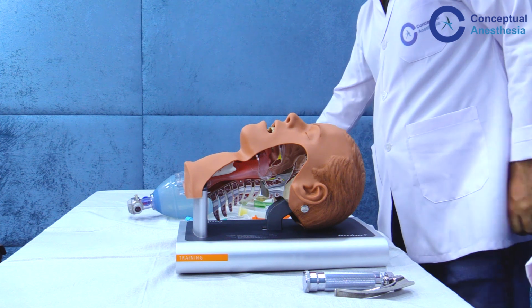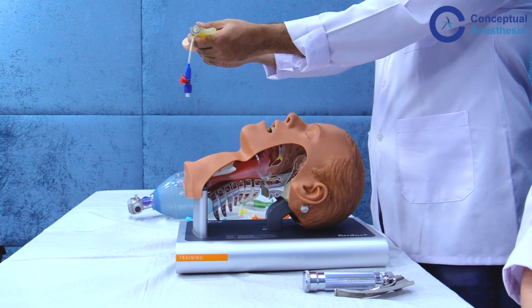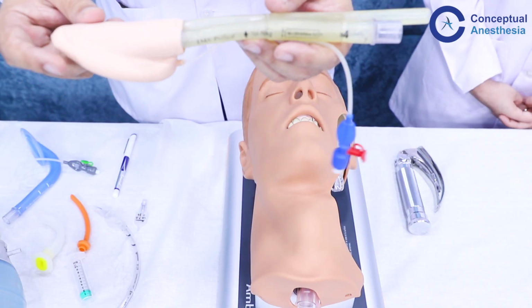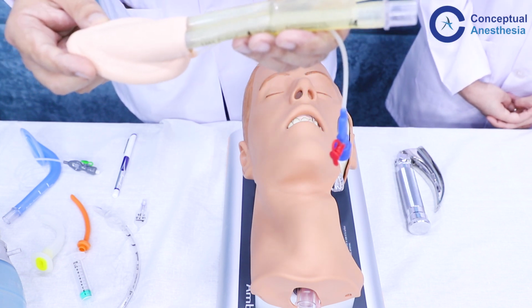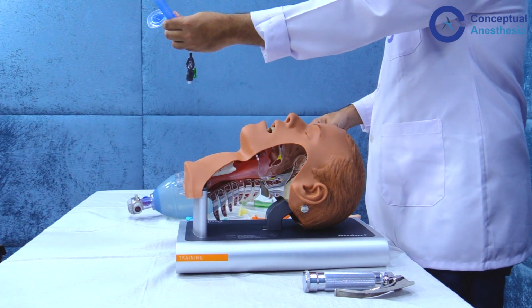So here we have the ProSeal supraglottic airway device. This is the ideal device to be inserted because it forms a good sealing pressure with the larynx and it also has less chances of aspiration. It is a second generation LMA. So we will be inserting the AMBU LMA in this patient.